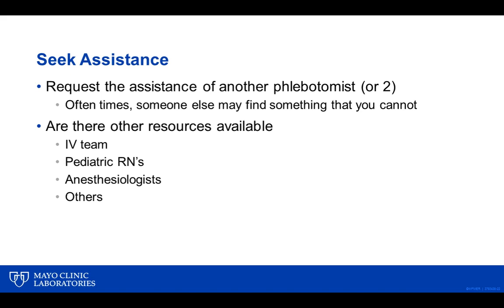We use gauze rolls here in 2x2s. We don't use Band-Aids, so we just have them squeeze on a gauze roll and hold that tight. And that helps pop the vein up too. Thank you for that question. Yes, that's a great comment.